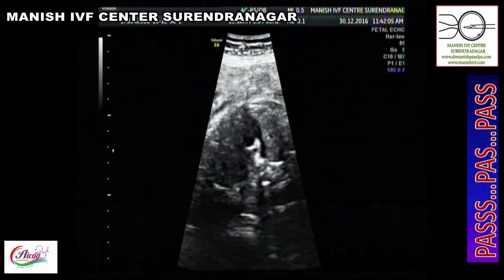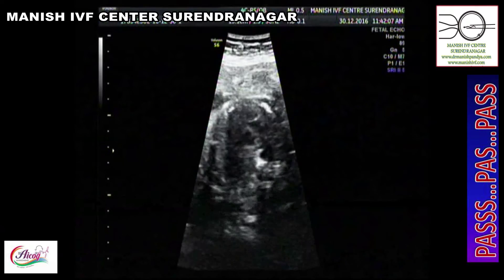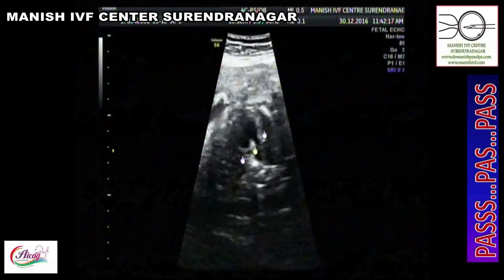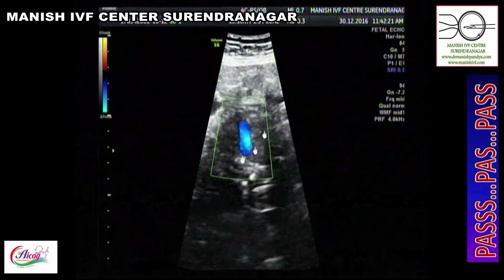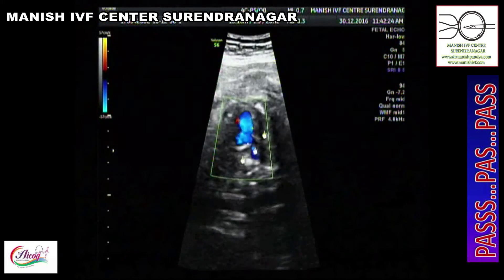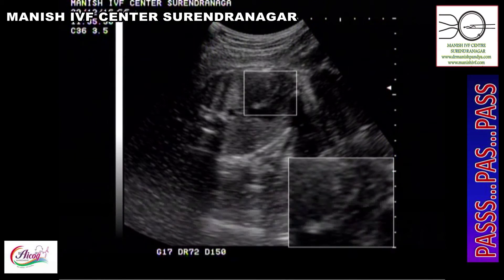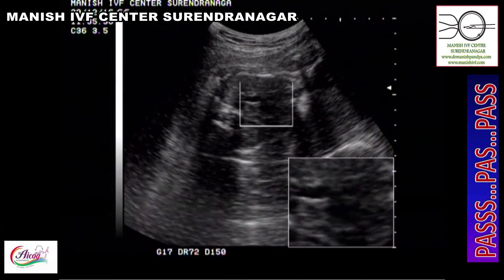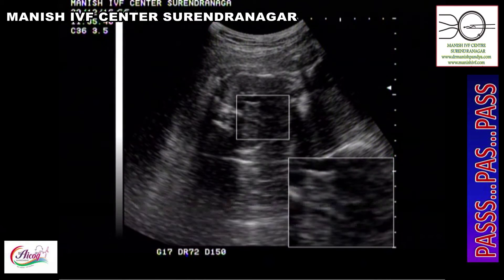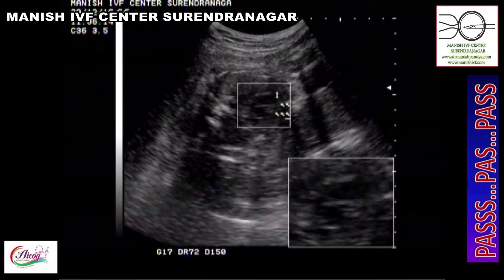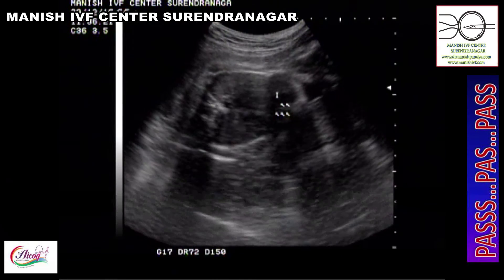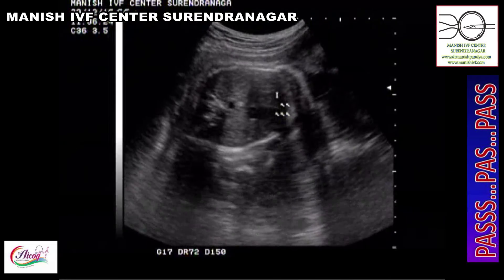The three-vessel view is an orthogonal view of the fetal upper mediastinum where the main pulmonary artery, ascending aorta, and SVC are arranged in a straight line and in decreasing order of size — like dot, dot, dash. With color, we see the inverted V sign. Four-chamber and three-vessel views do not require a high-end machine and can be practiced on a simple 2D machine with cardiac settings. The PAS view is the most important view in fetal echo, easy to obtain especially in early gestation, with anatomical landmarks easy to identify — and in all major congenital heart disease, the three-vessel view is always affected.